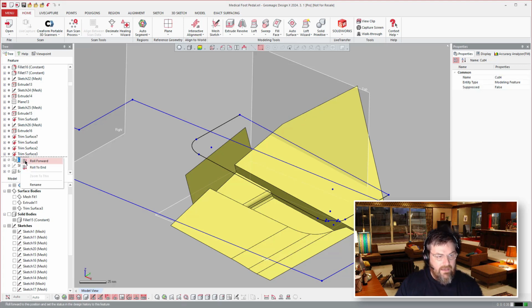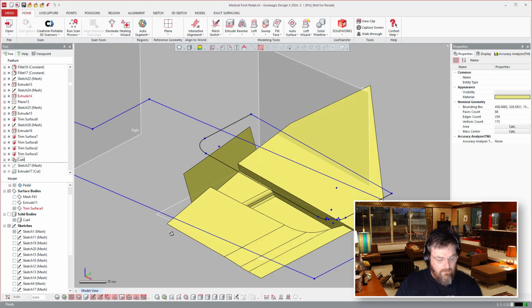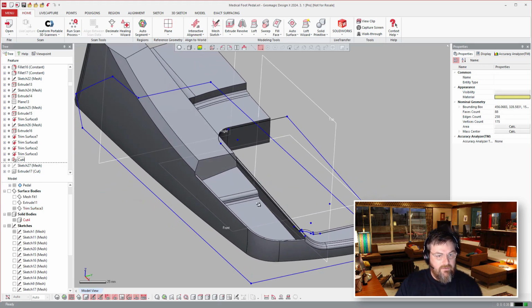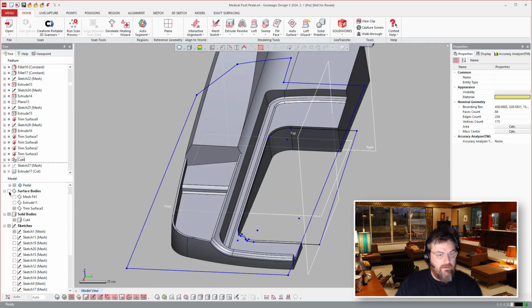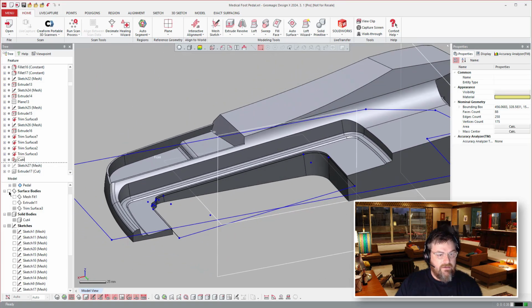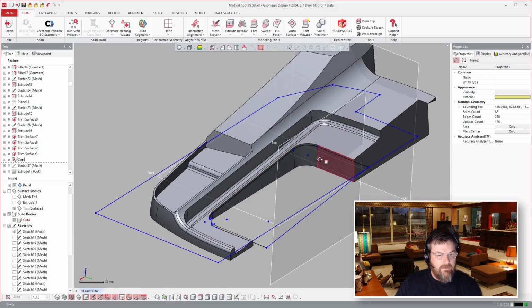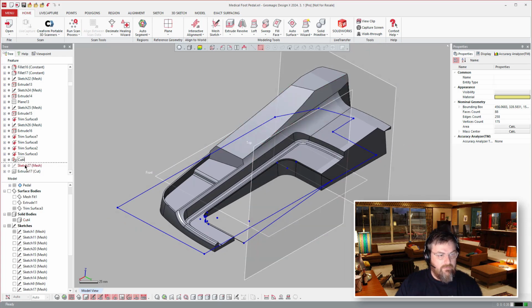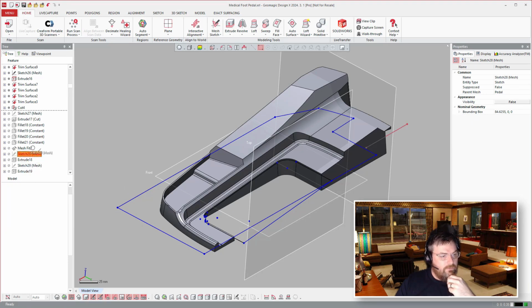But now, after they created this tool, then you go ahead and say, hey, now I'm going to cut this away from the main solid body. So now, make sure to turn that off and this on. We cut that away by cutting this guy out. You see that? Just break it down into sections, right? So now we're working on this area. We cut that away. After we cut this, we cut that, this we rewind back.